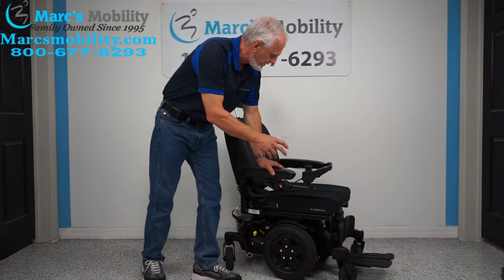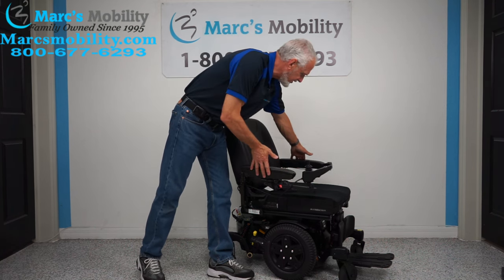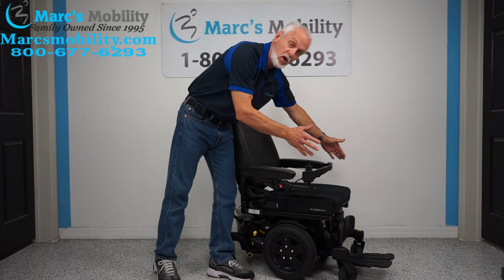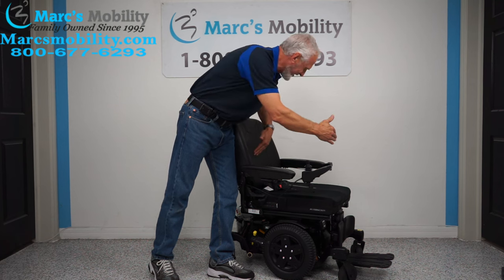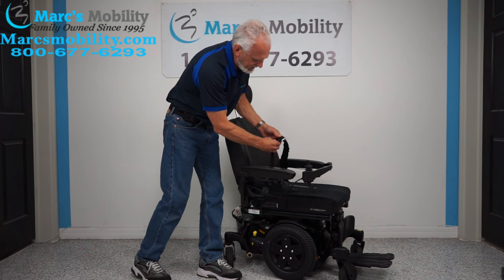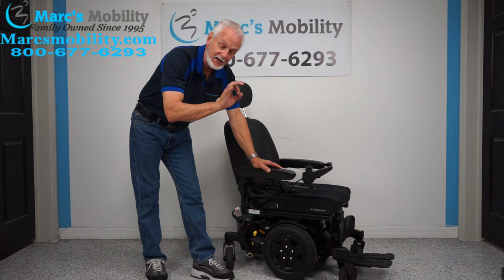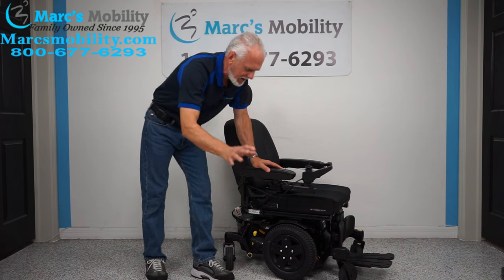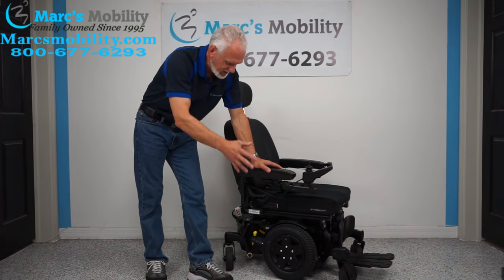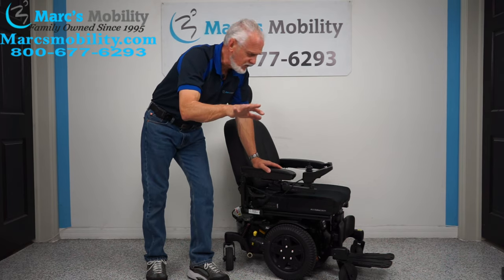So folks, this chair has a 300-pound weight capability. It's built solid. Just remember the arms are 25 inches from outside to outside of arm. You have the swing-away joystick. The cushion is 19 inches wide by 21 inches deep. You have a captain's seat that can be folded down. You have a headrest, you have the lights, solid tires, and suspension all the way around. Again, this is the Quantum Edge Stretto. This power chair does not have a meter, so we can only go by the tires — it was probably used about three or four months. It's in practically new condition with no wear on the back tires.